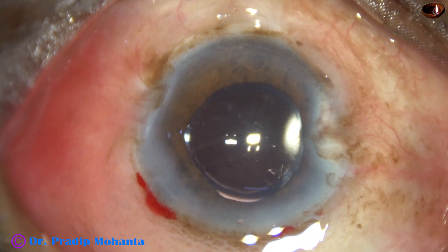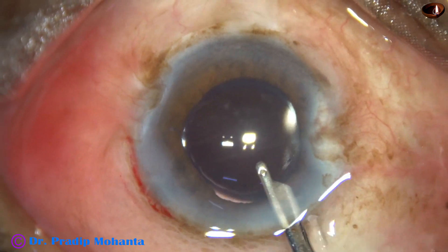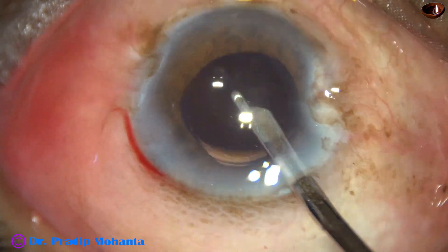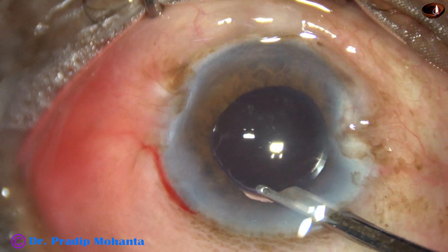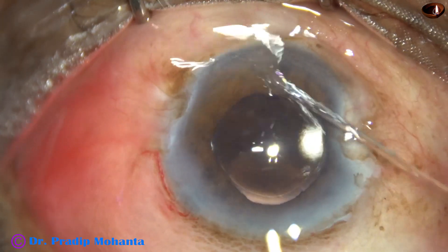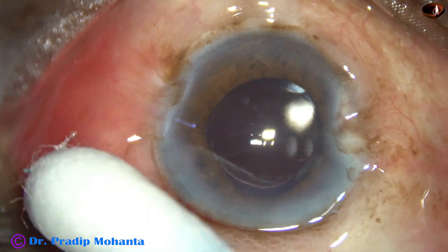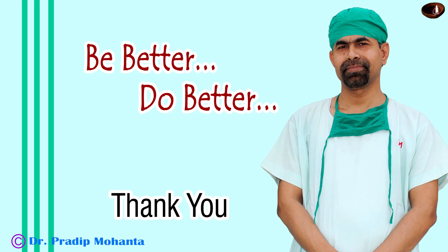The message I want to convey in this surgery is that it is not necessary that if the patient is very old the cataract will be very hard. Sometimes young patients may have very hard cataracts, and we can easily operate on elderly patients because it is not necessary that they will have weak zonules. Thank you very much for your attention. I hope this video will help you in developing your surgical skills and encourage you to operate on elderly patients. This patient is 104 years old, can hear well, and the other eye has been operated on by me a few days back and is doing well. We are hoping that this eye also will do well.